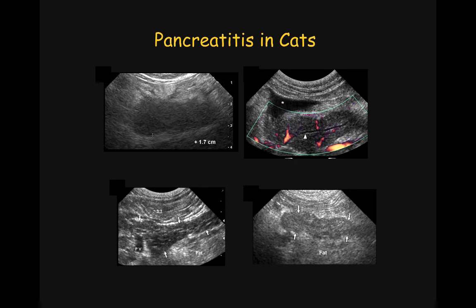Pancreatitis in cats can be more challenging to diagnose, as the clinical presentation can be more subtle and confusing than in dogs. As much as pancreatitis seems to affect preferentially the right lobe of the pancreas in dogs, it commonly affects the left lobe in cats. In cats, most commonly we will see only one or a few of the supportive features to support the diagnosis, and therefore the changes may not appear as obvious as in dogs. Let's look at a few cats with pancreatitis.